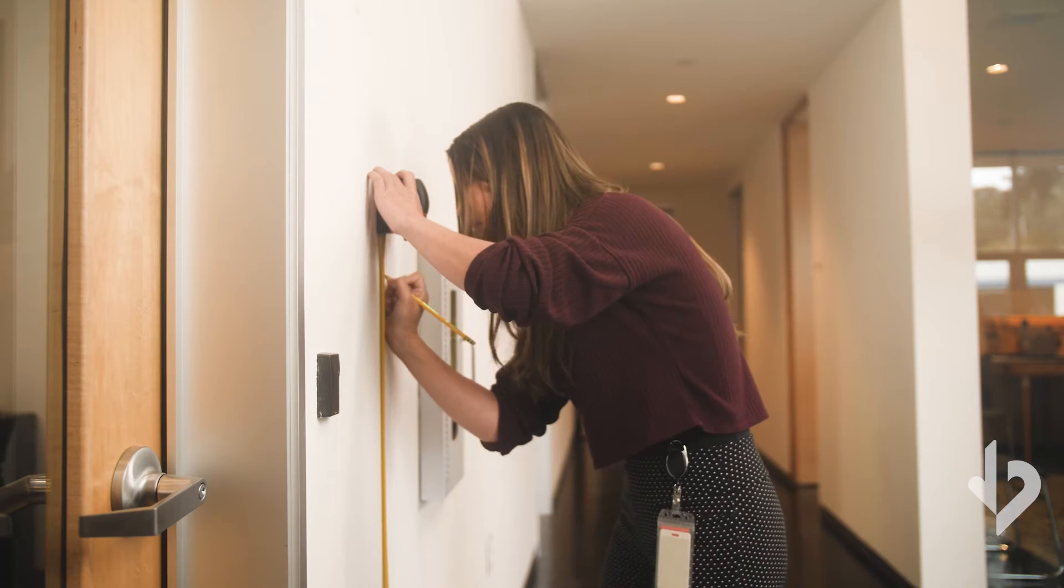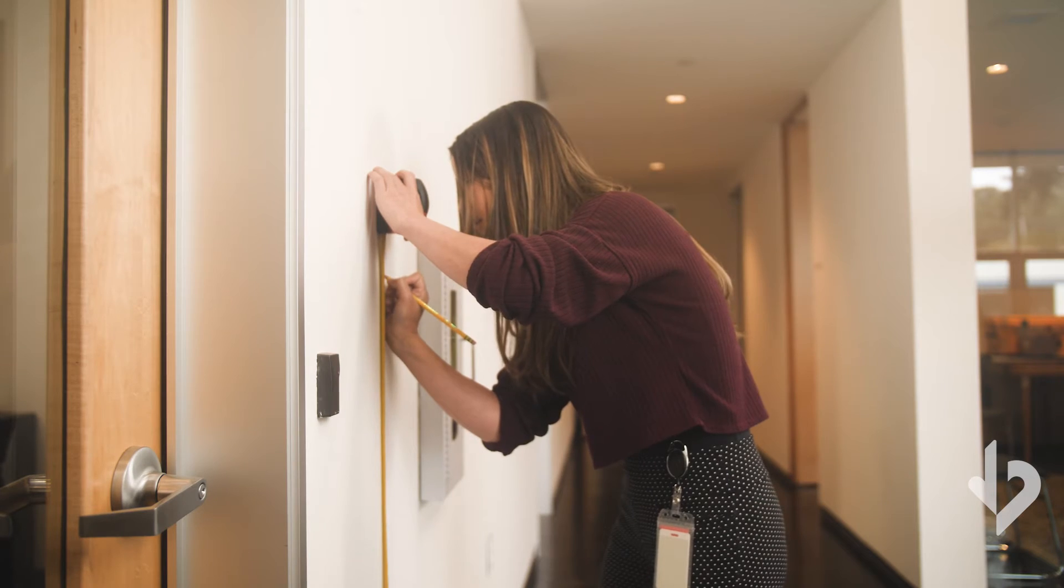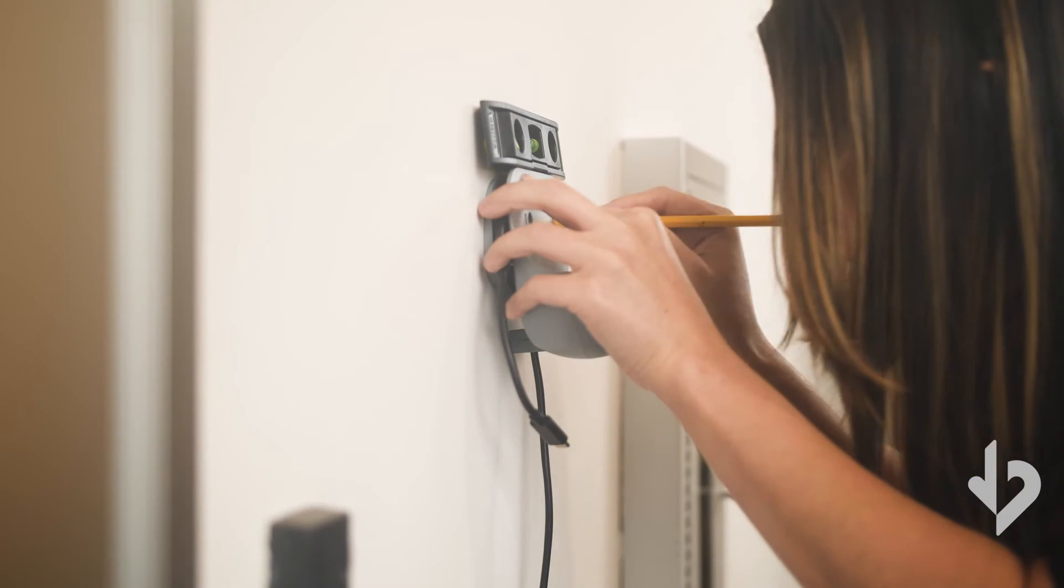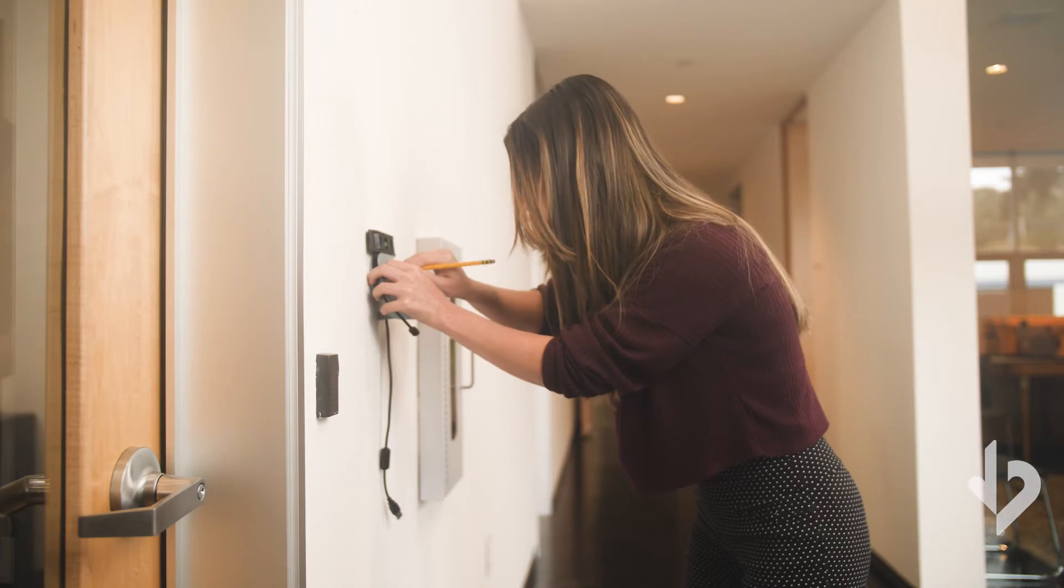Measure the proper height, in most cases this is 48 inches from the ground, and mark where the holes will be drilled.